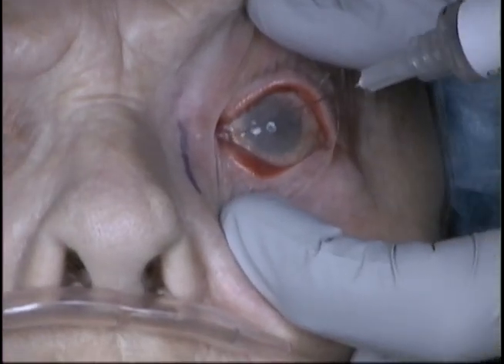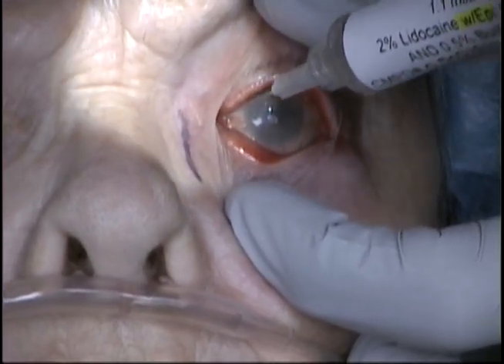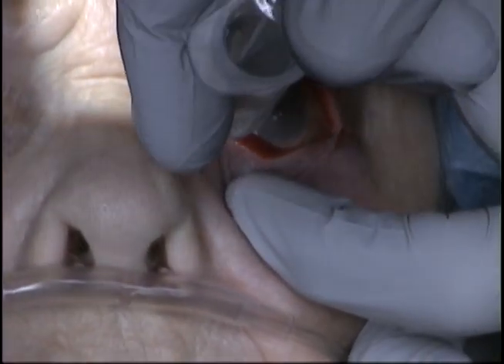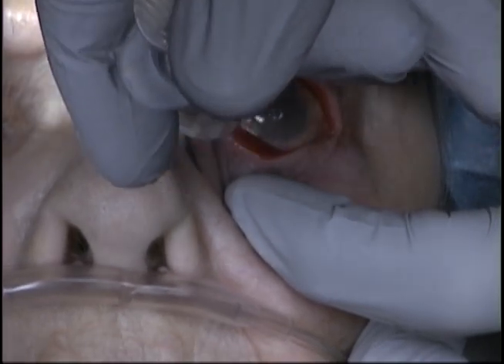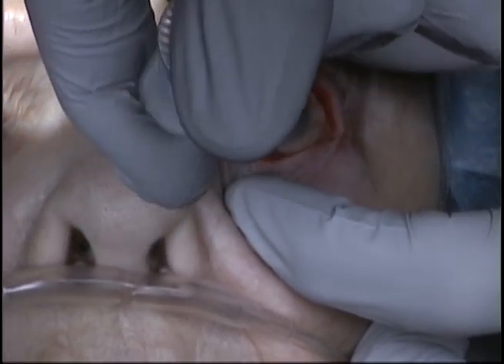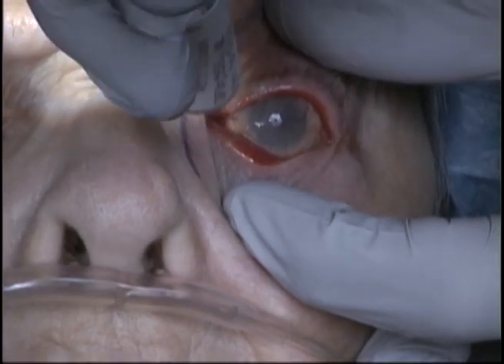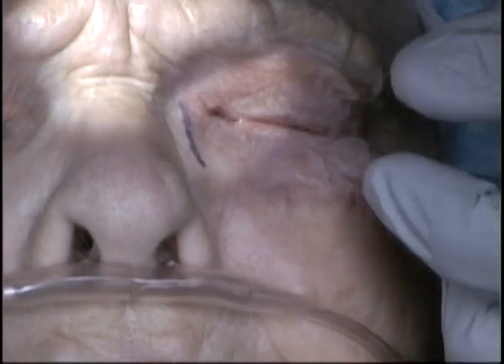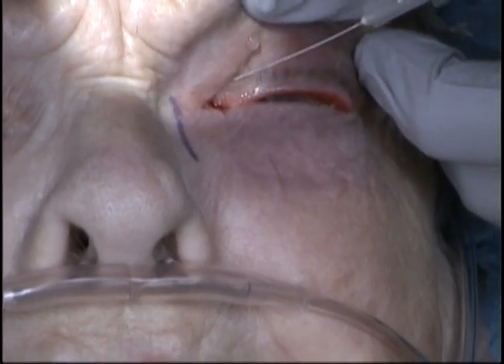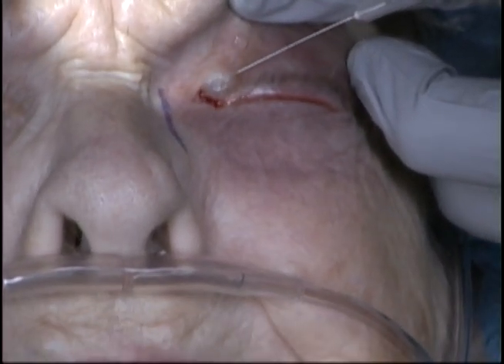The injection is then placed by entering the caruncle and palpation of the medial orbital wall with the needle. Approximately 1 cc is placed of lidocaine with epinephrine. Additional local anesthetic mixture is then placed along the medial portion of the upper and lower eyelid.